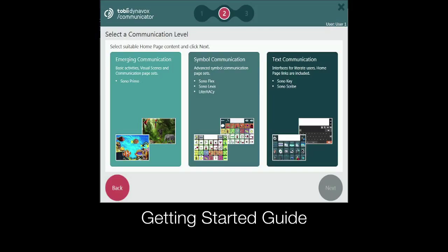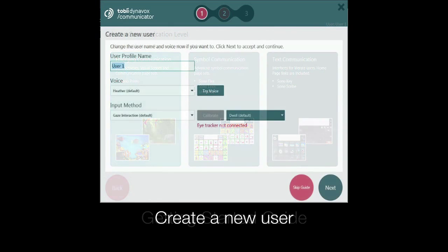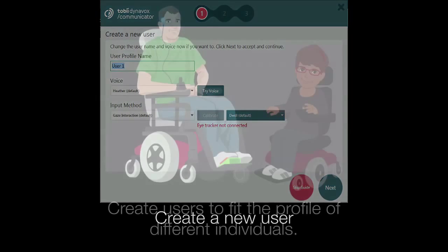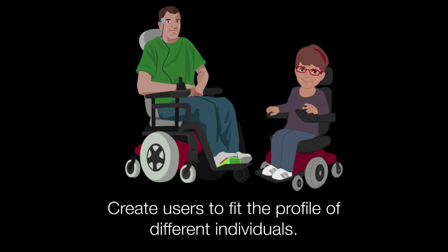After completing the Getting Started Guide in Communicator 5, you created a new user based on your needs and abilities. While this user can be modified as skills change, there may be times when you want to create a new user.